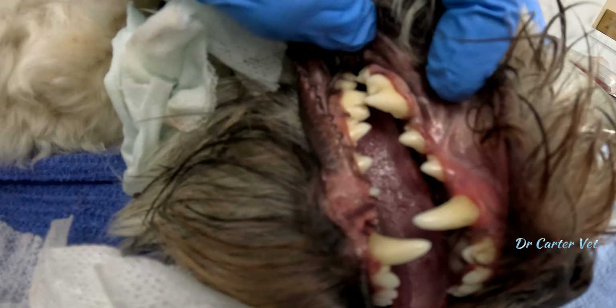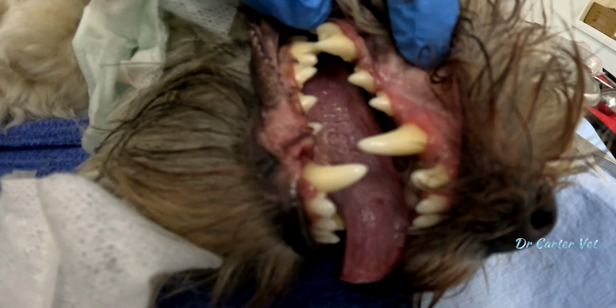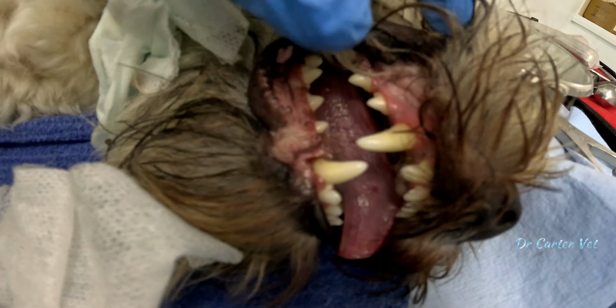But the dog is anesthetized. I use injectable anesthesia. Some people use gas anesthesia, but I do total injectable anesthesia. It's more reliable and safe on the animal. And I'll be finishing in a few minutes.